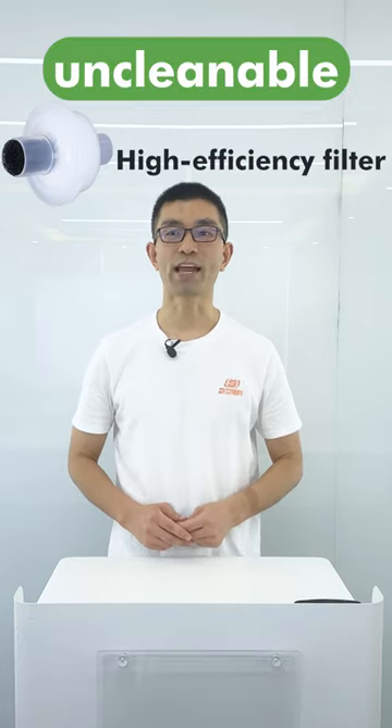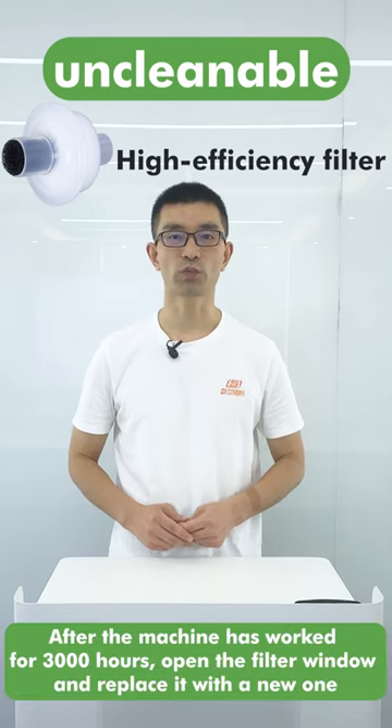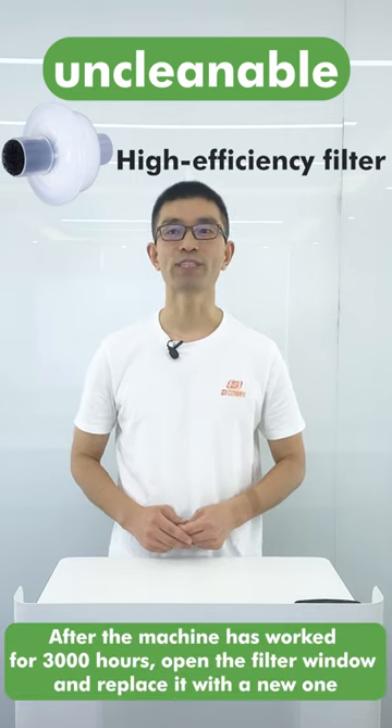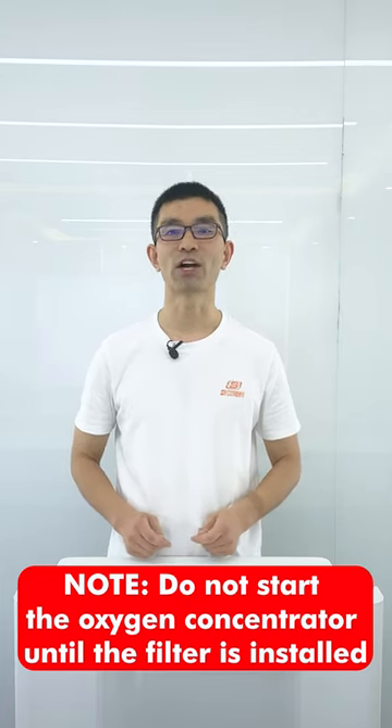The high-efficiency filter cannot be cleaned. After the machine has worked for 3,000 hours, open the filter window and replace it with a new one. Do not start the oxygen concentrator until the filter is installed.